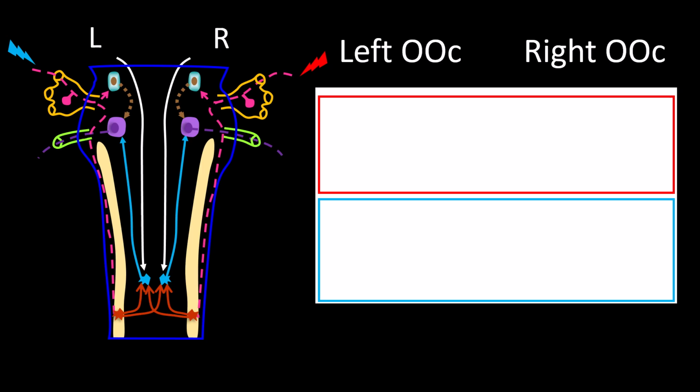It is important to stress that, as you saw in the example of the blink reflex test we used early in this talk, not all labs use the same arrangement to display the results. So after making this clarification, let's see what happens following right-sided stimulation.